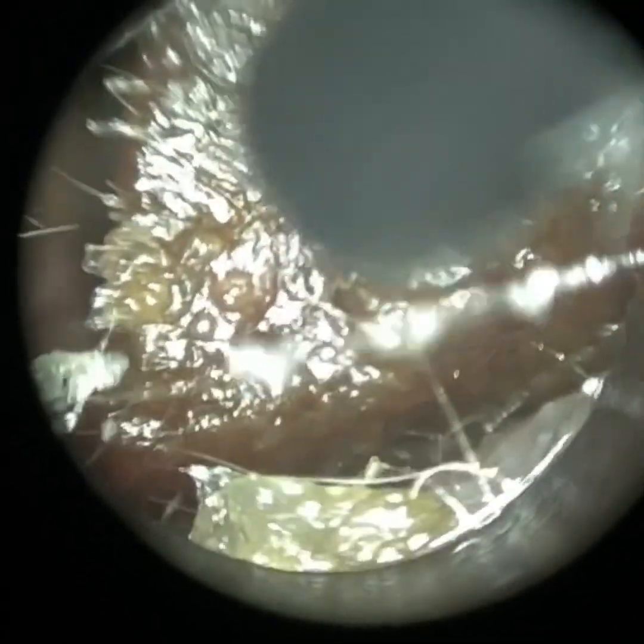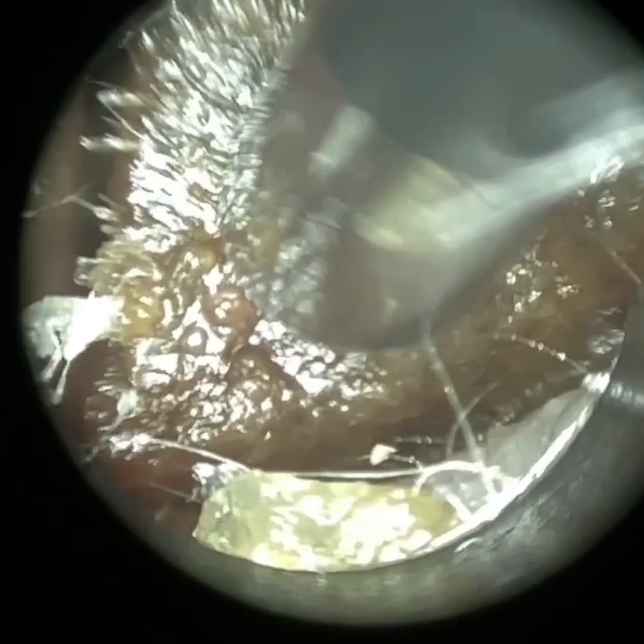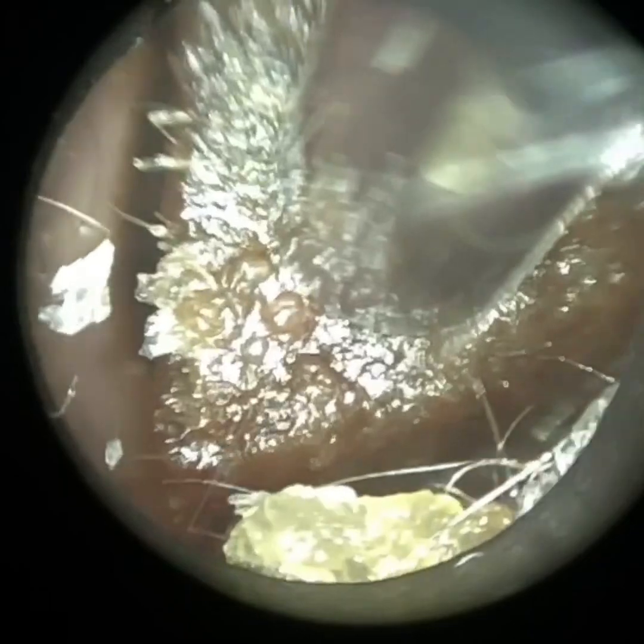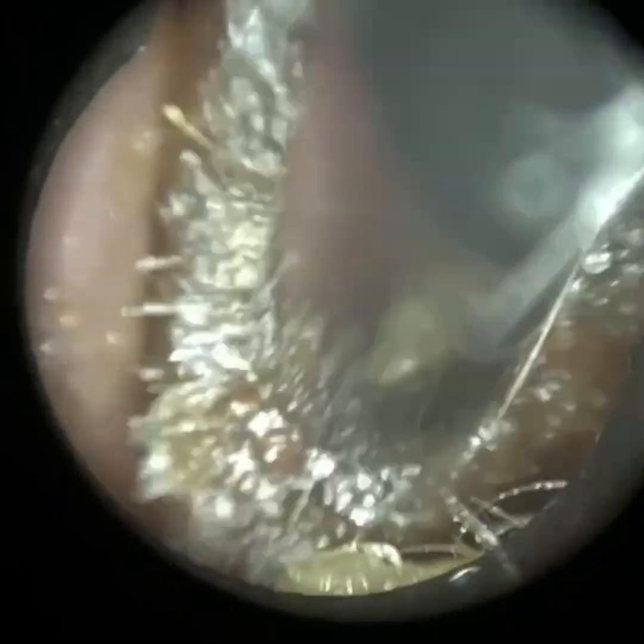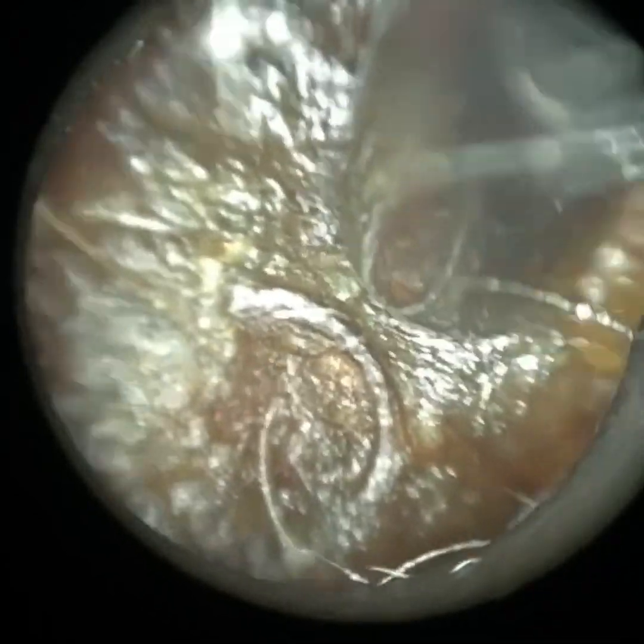It's quite a dense plug of wax they have here, and it's extending right from the entrance of the ear canal all the way to the eardrum. Currently we're just working beyond their first bend, which is about half a centimetre into the ear canal. We know that because we can see some hairs protruding from the right-hand side, which is quite commonly found on the first bend.